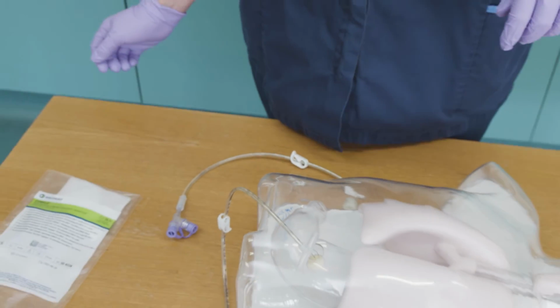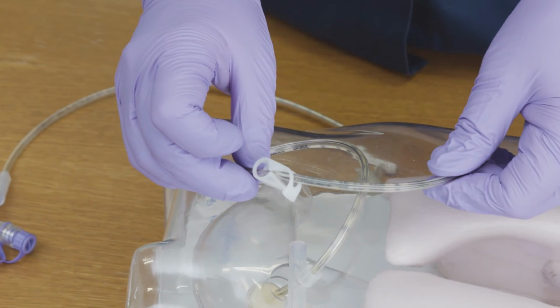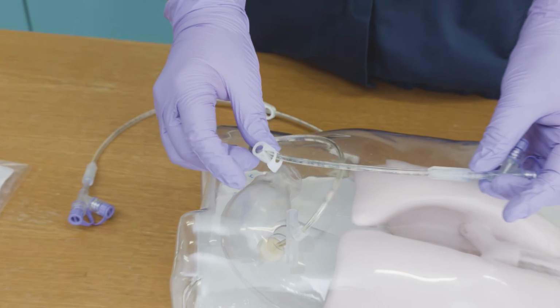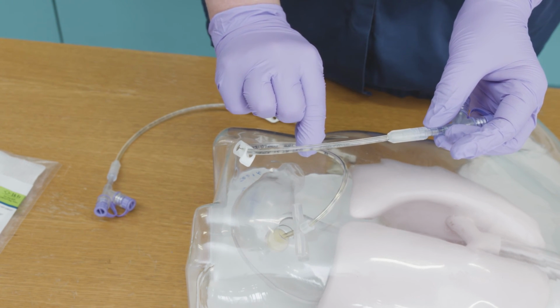If you need to replace a clamp on the Corflo PEG, you will also need to follow the instructions just given, as the Corflo Y adapter will also need to be replaced at the same time. Please note that you will need to pinch the tube when replacing the clamp to avoid leakage of gastric liquid.